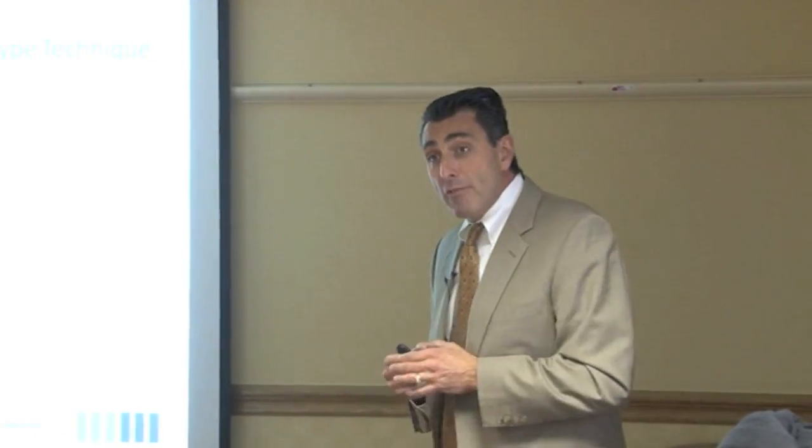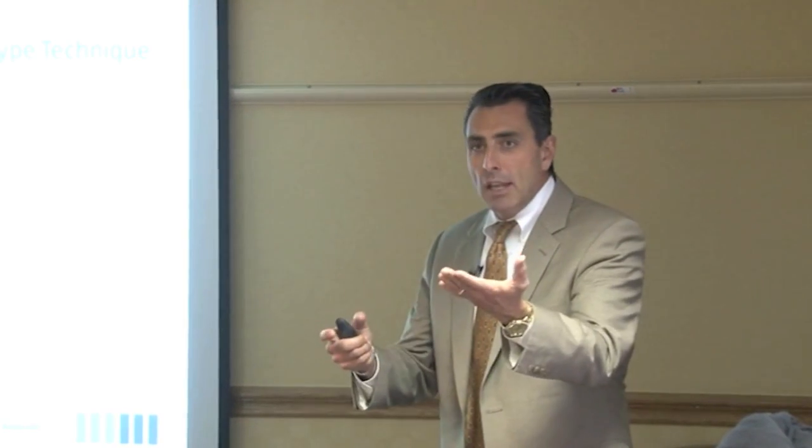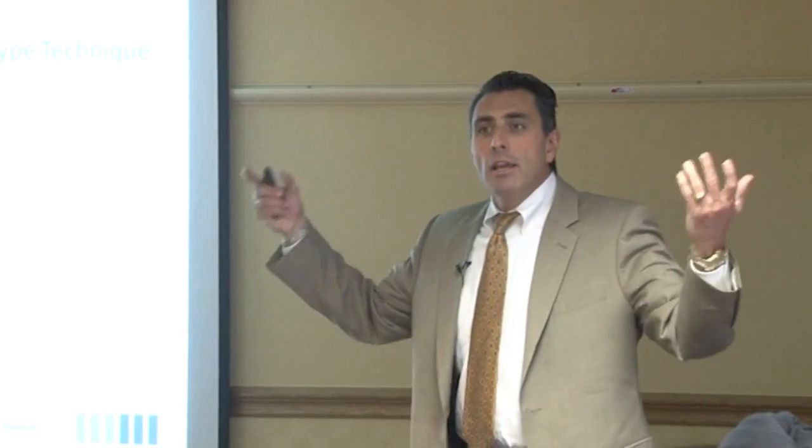Now, I've tried to take out a couple of those things. I've talked to some of my colleagues who have tried to take them out, and they integrated. Bone grew over them, and it's almost impossible. You have to cut them out. So when he brought this to me, I was like, yeah, this makes a lot of sense. We should be able to do this. We should be able to take this platform and actually place it in trabecular bone. If it's made of titanium, as we talked, our titanium alloy, it should integrate.